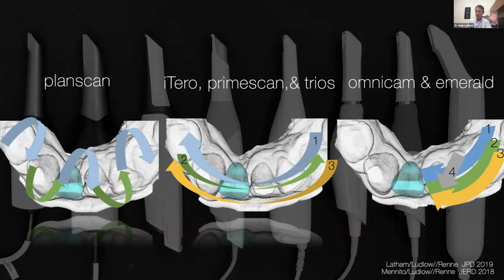So what I recommend to everybody watching this is, if you want the best fidelity or you've had some problems with fit, make sure you talk with your company, whichever brand of scanner you bought, and ask them what the preferred scan pattern is for their particular machines, because you want to give those algorithms the data in the best possible way. Okay?